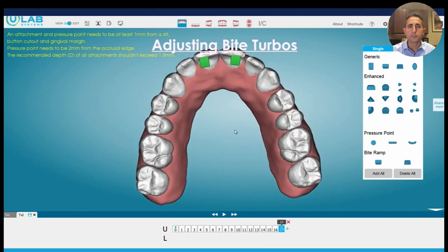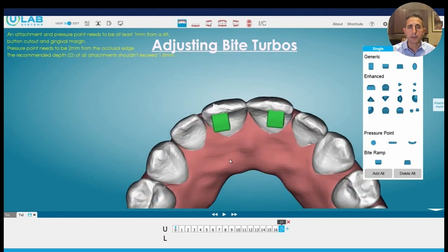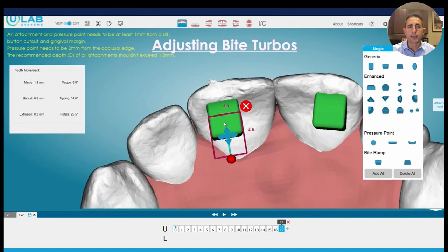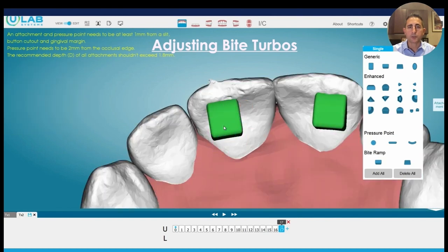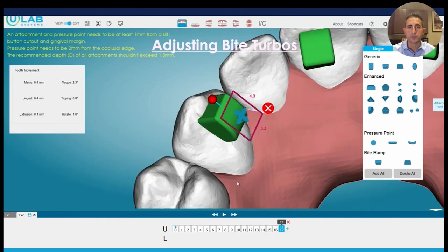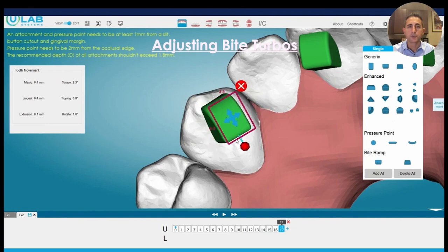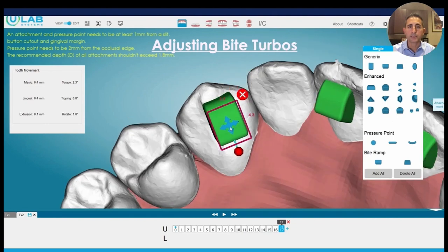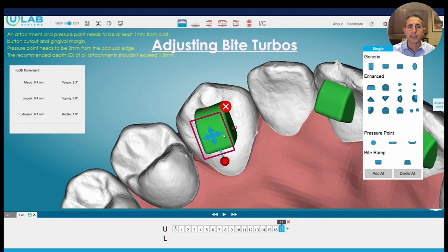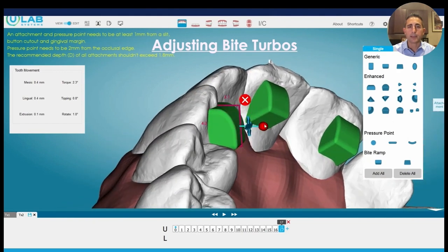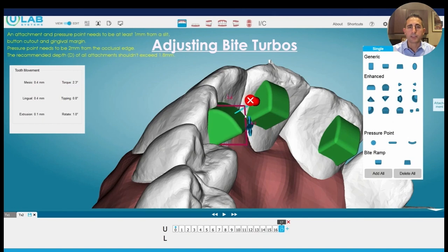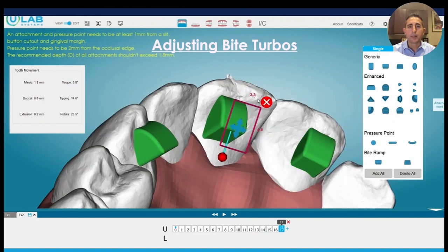Maybe it's not hitting, or maybe you want to move the turbo to a different tooth — also not very difficult to do. We can grab that turbo, press Ctrl+C, which is the shortcut for copy, and paste it on another tooth. This is how I set up my turbos: basically turn them upside down, increase so that you have the rounded area on the front, and then adjust it to the size and shape that feels appropriate.